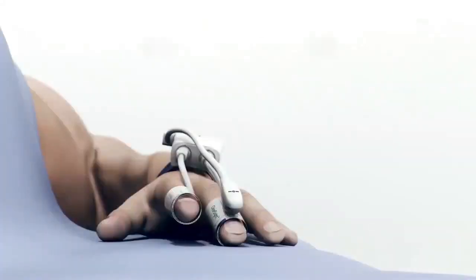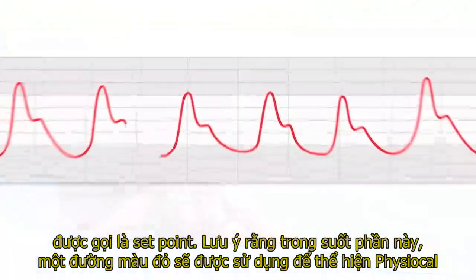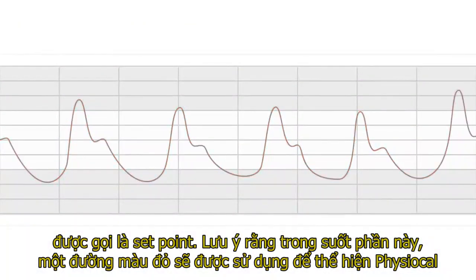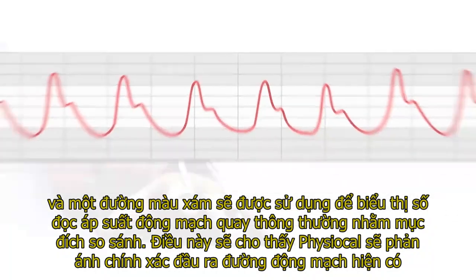When measurements are initiated, the ClearSight system runs PhysioCal, the real-time process which calibrates the blood pressure measurement by determining and periodically updating the target unloaded volume, known as the set point. Note that throughout this section, a red line will be used to represent PhysioCal, and a gray line will be used to represent a traditional radial line pressure reading for comparison purposes. This will show that PhysioCal will accurately mirror an existing arterial line output.